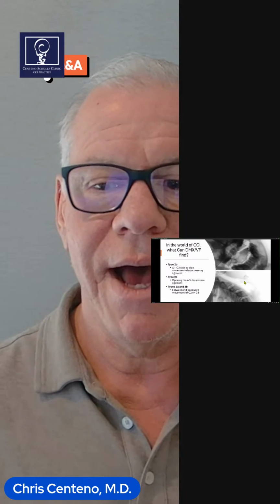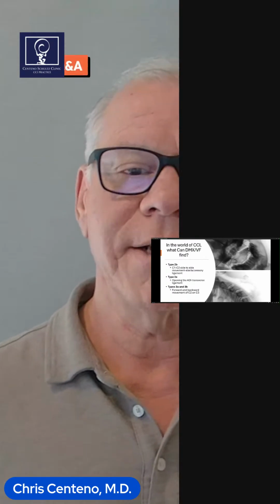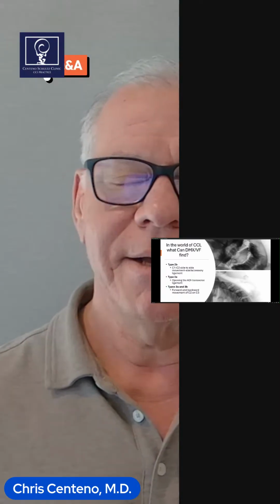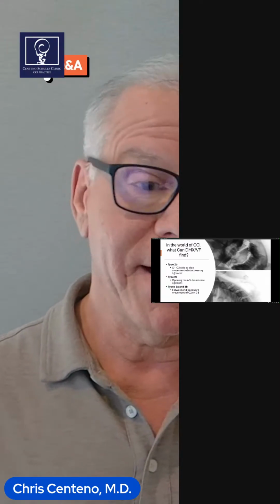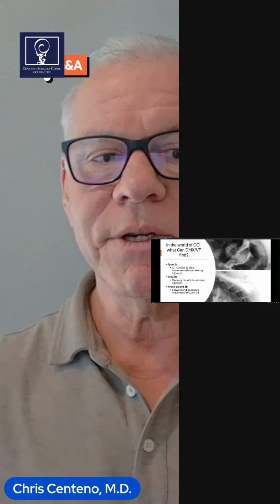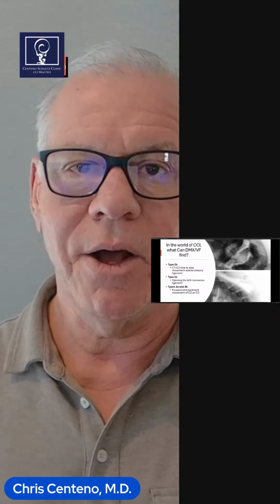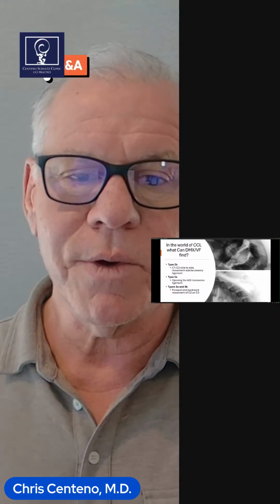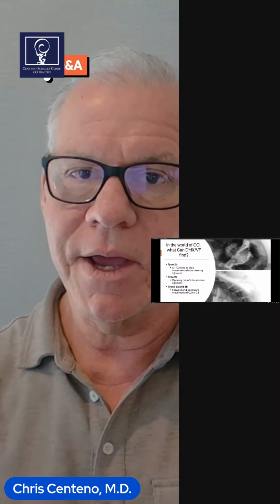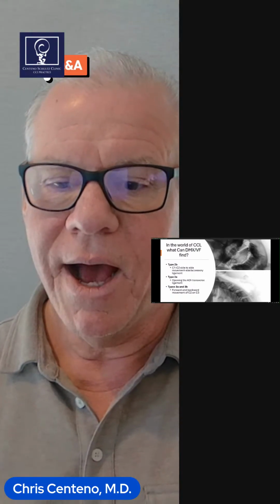So in the world of CCI, what can DMX or video fluoroscopy find? It's really good for looking at type 2B. In fact, I think it's the only way to get to a type 2B instability, and that's where C1, C2 has too much side-to-side movement. That's the alar and accessory ligaments. Also realize that that's a surrogate for C1, C2 rotational movement as well.